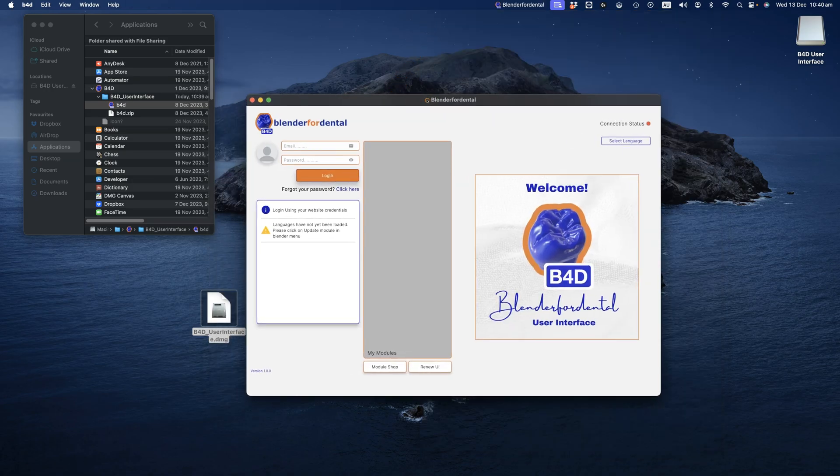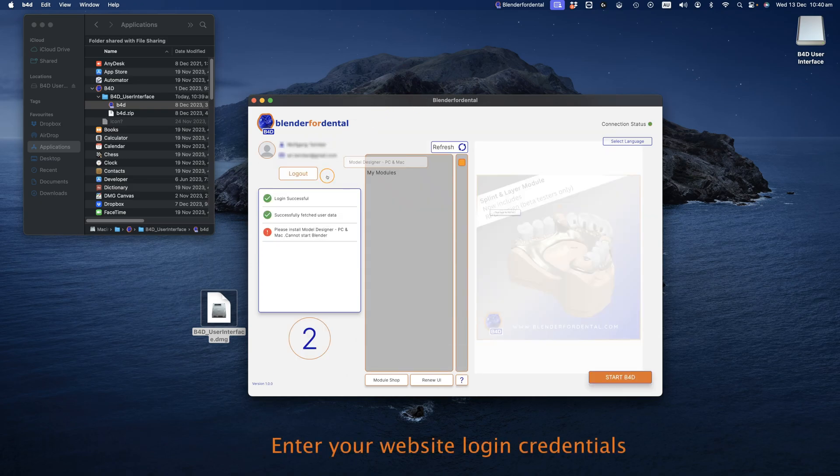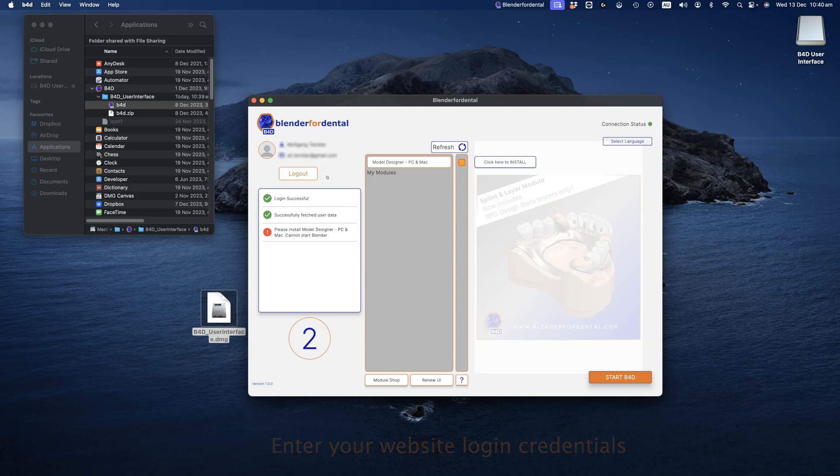Enter your user credentials, which are the same as the Blender4Dental website. Next, install the Model Designer, a prerequisite module for Blender4Dental.